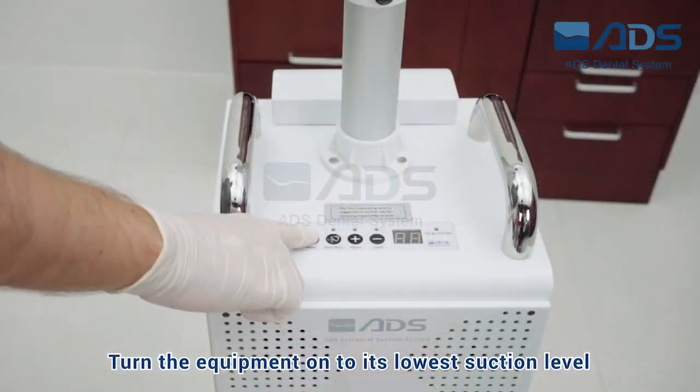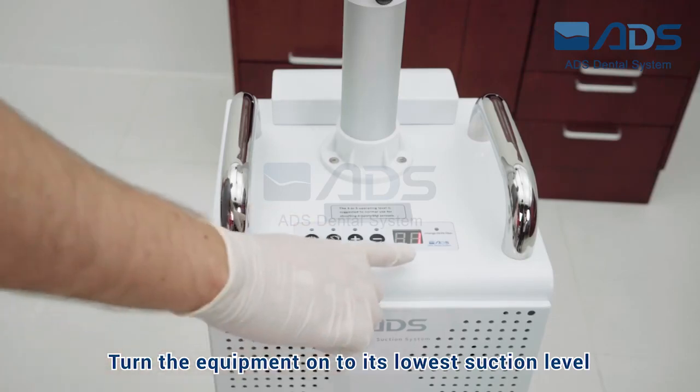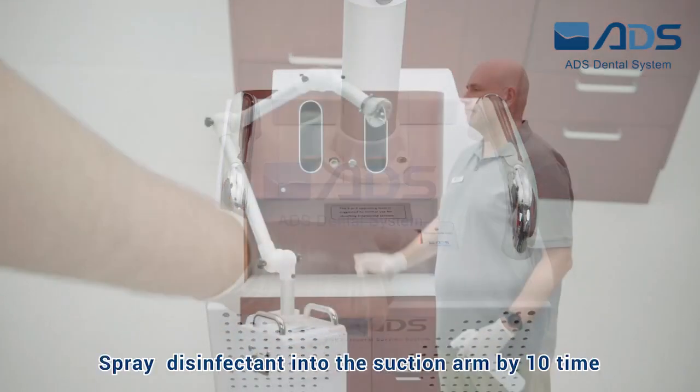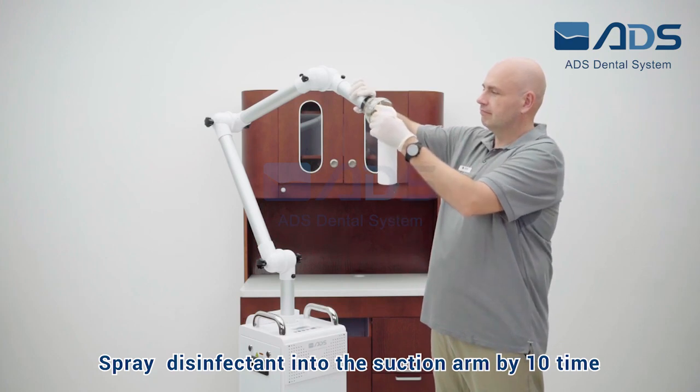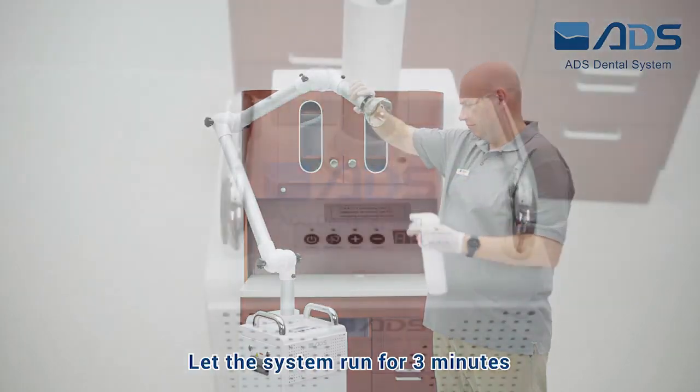Turn the equipment on to its lowest suction level. Spray disinfectant into the suction arm 10 times. Let the system run for 3 minutes.